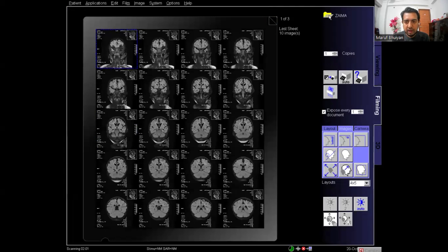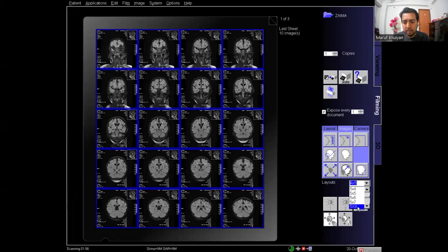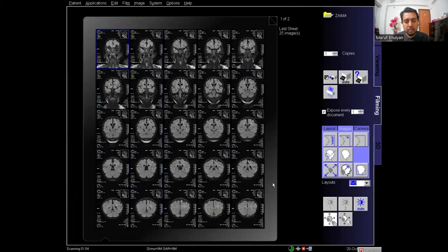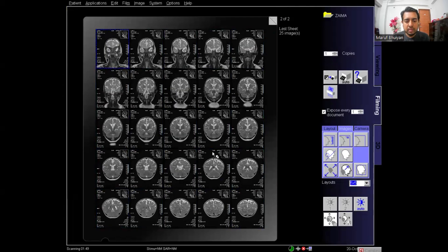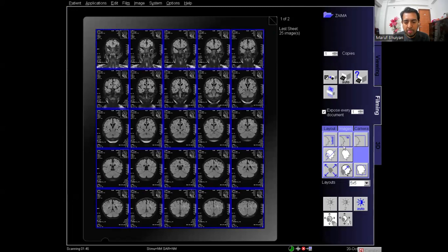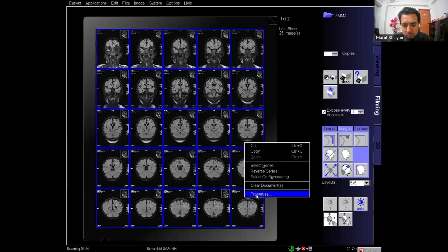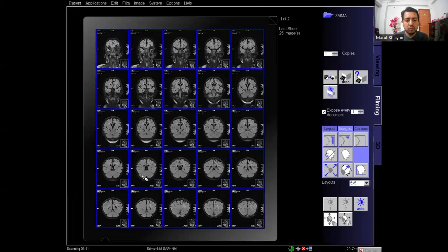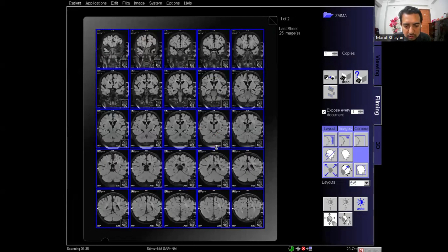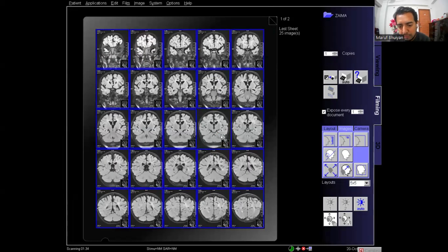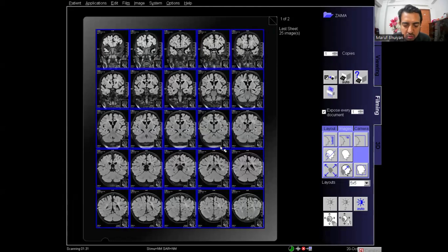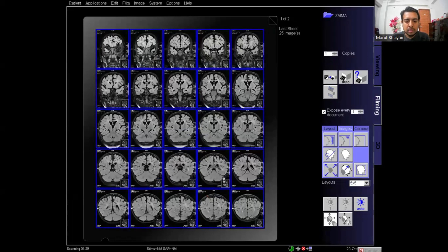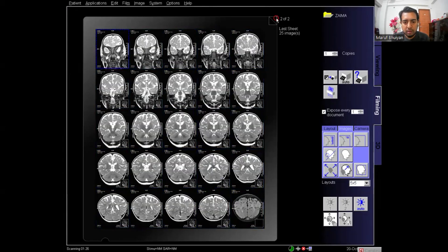Because there are 25 images, I select the patient folder and choose the 5 by 5 layout. All 25 images fit in the film — one field is T2 coronal dark fluid and the other is normal T2 coronal. These two are the main epilepsy protocols planned on the hippocampal area, as an oblique coronal plan with slices perpendicular to the hippocampus.